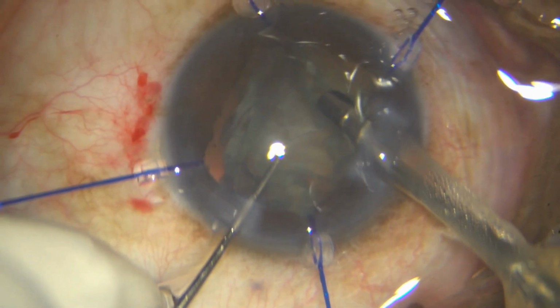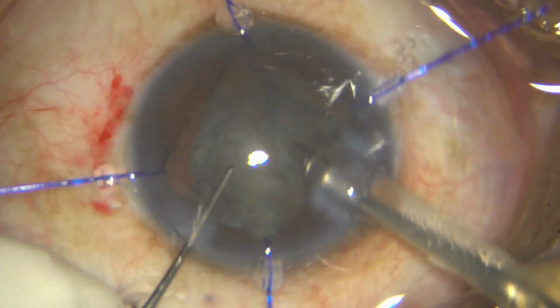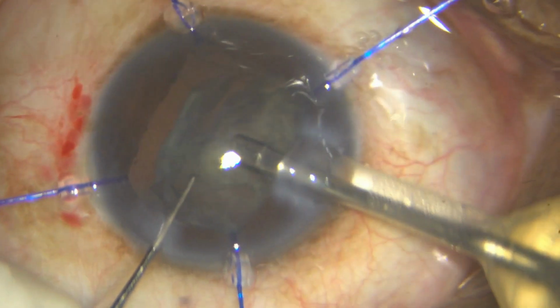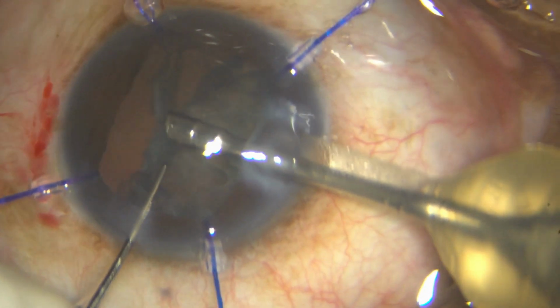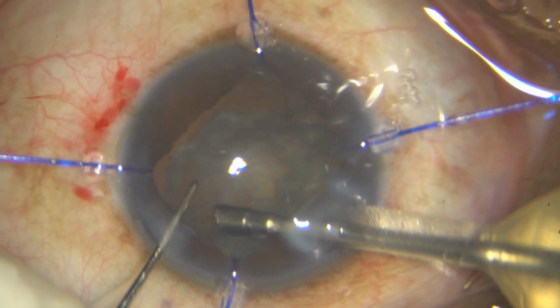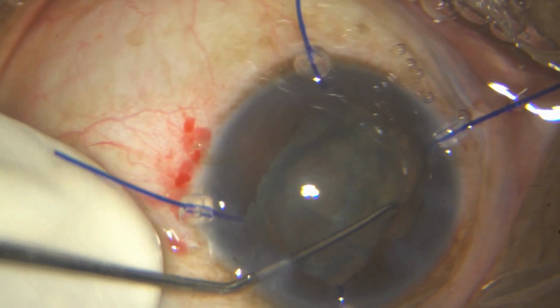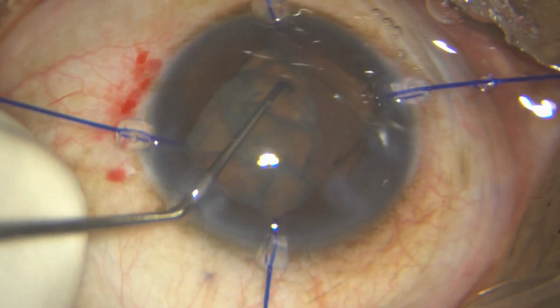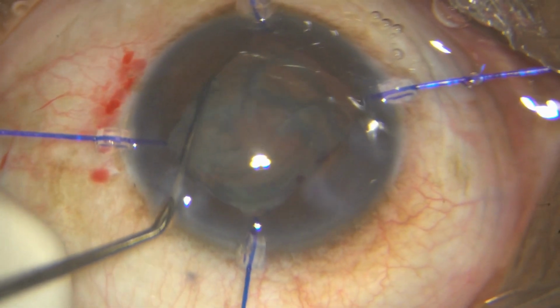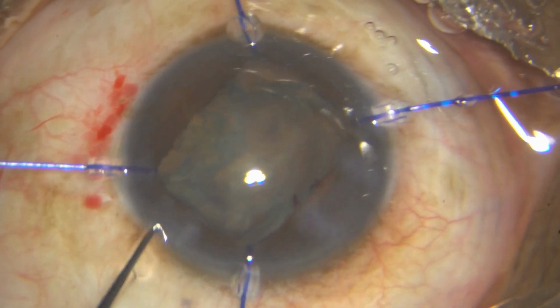Such a thick epinucleus will take such a long time if you try to do it with your IA probe. So it has to be done with the Phaco probe. However, the superior part is very stubborn, so I put in some HPMC, come out, put in some HPMC and rotate that part to a more accessible area. And in these cases, I think this is what is required, a lot of patience. You try to hurry anything here and you're going to land up with a complication.